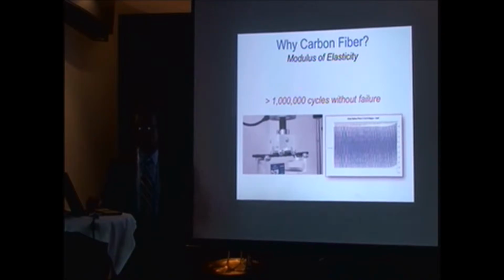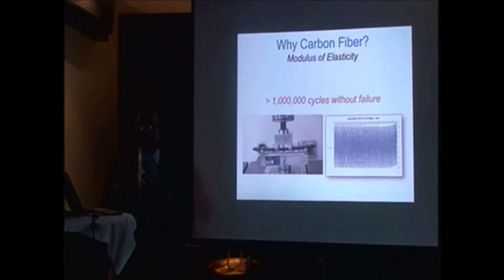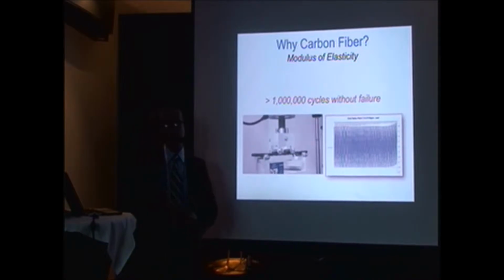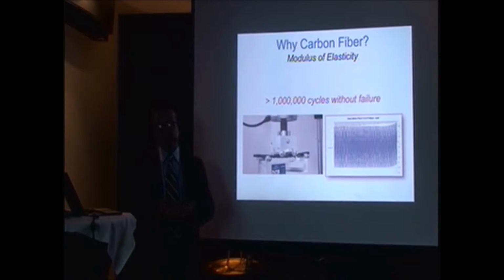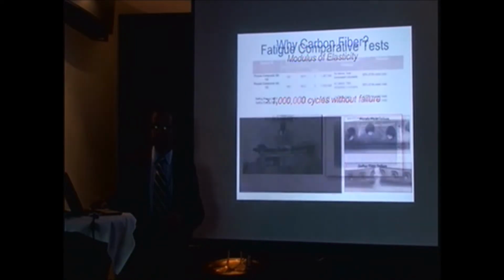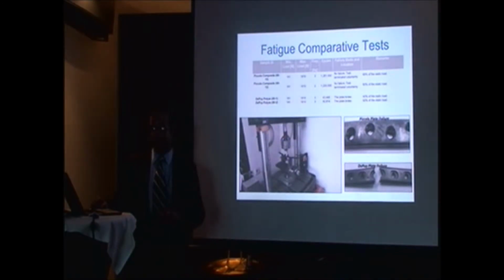And you can see that another big advantage, and I think he showed this too, is the fatigue properties. Obviously, metal is like a paperclip. In the United States, we would say it's a race between biology and metallurgy. If you can get the bone to heal first, you win. If you can't get the bone to heal, it's just a matter of time before the metal fails. And that's true still today. And I think the limiting factor, even in carbon fiber, is not going to be the carbon fiber implant. It's probably going to be the interface between the implant and the bone.